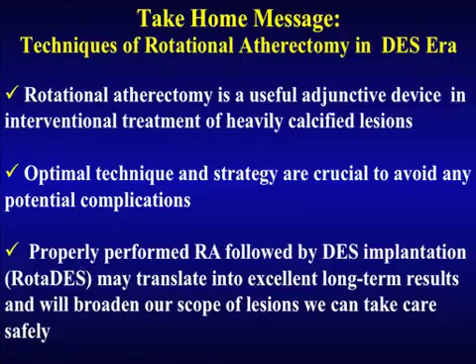Even, as you saw, with the burr at 2.25 and then 2.15, one area remained very recalcitrant, which we clearly saw at 12 o'clock, with no full expansion. Of course, we went with the 4.5. Otherwise, you go to high pressure, and you have more chance of perforation. In my opinion, in a heavily calcific lesion, rotational atherectomy will actually decrease your complications, particularly perforation.